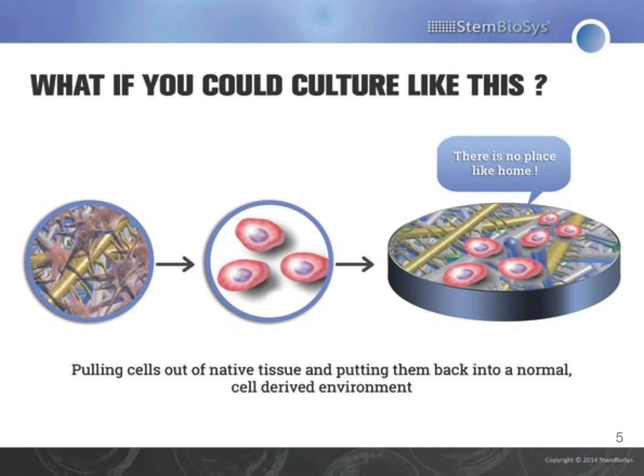So what we're trying to do here is change that scenario in that you can isolate cells from their extracellular matrix and their normal environment and put them into an extracellular matrix that was produced and built by cells. So this is not an extracellular matrix or a protein that's been extracted, purified, and coated onto a dish. This extracellular matrix is actually built by cells onto the surface. And that's what we're using to put cells back onto when we do this cell culture method.